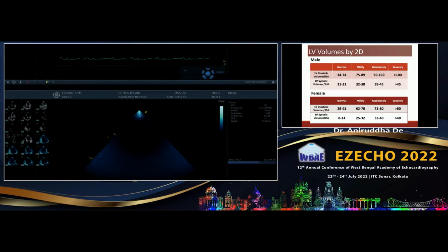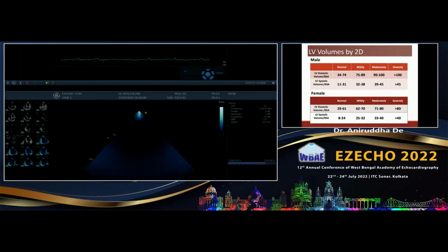See, many times we have a tendency, if we are not getting the view, to make the patient tilt towards us, which is actually very, very wrong. Let him be lateral, and then go from lateral to medial. So just get a good cutout, and your imaging will suddenly improve. And keep on adjusting till you get a conical apex and a visually largest volume. Then there is a possibility that you are in a perfect long axis view.